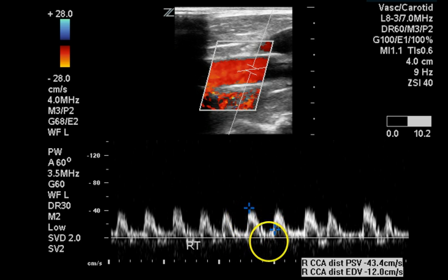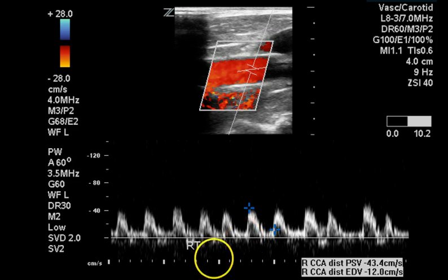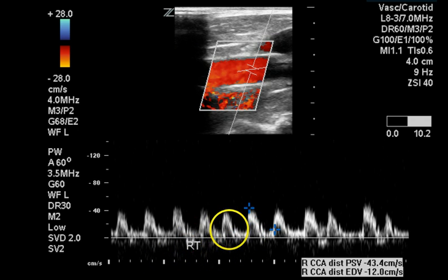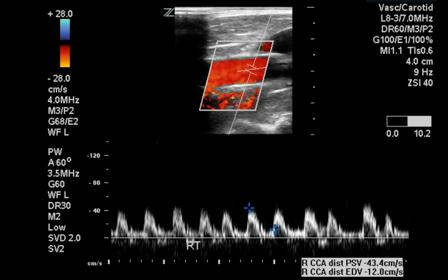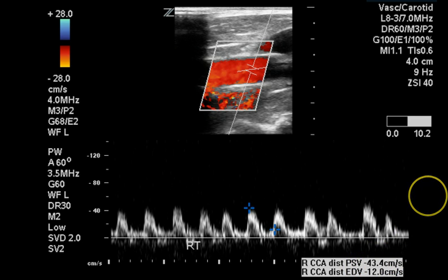This is a normal-looking waveform, although the heart rate is quite rapid. From one point to the next is one second, and there are at least two waveforms in that interval, so this heart rate is at least 120 beats per minute. The flow rate at peak systole is only 43 centimeters per second, which is a rather low flow velocity for a distal common carotid artery.